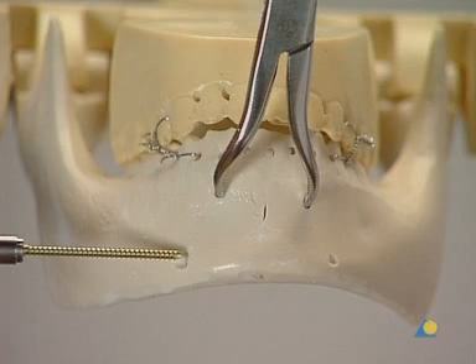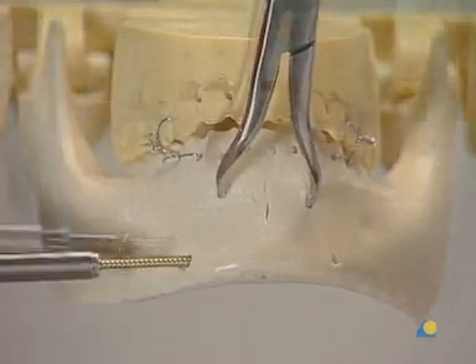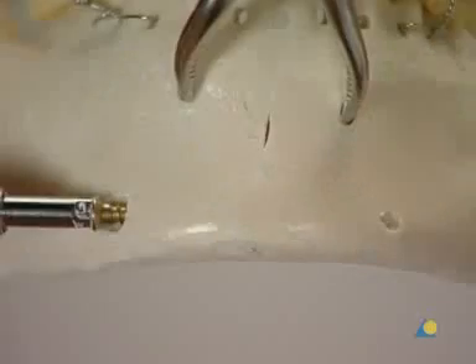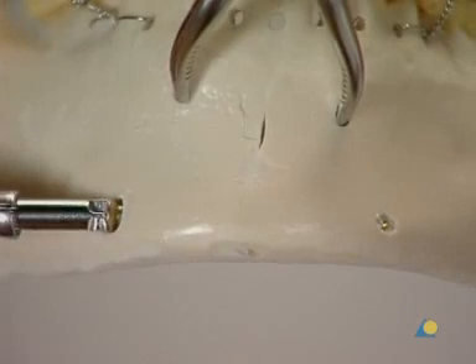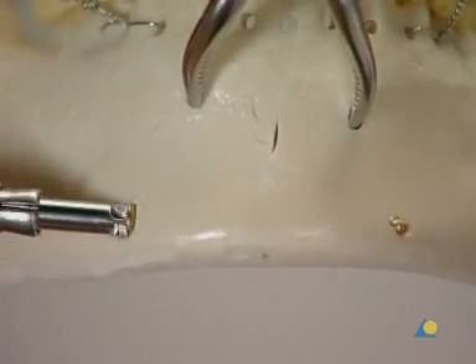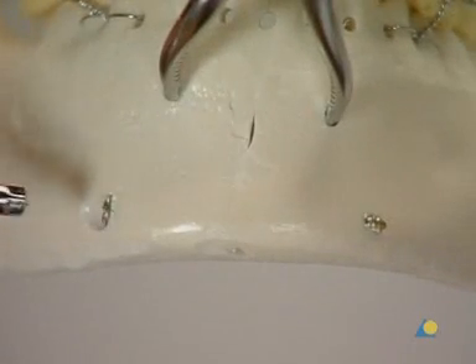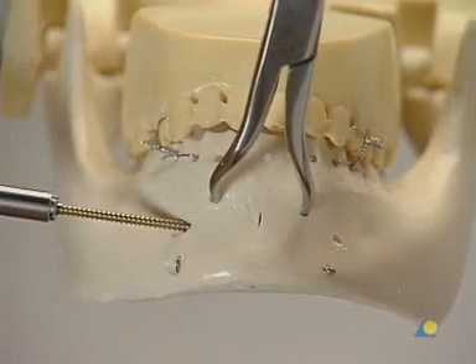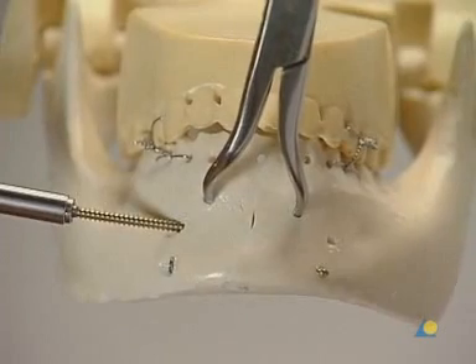It should be noted that the 2.4 mm screw glides through the near hole while engaging in the far fragment. Compression is achieved as the screw head engages into the countersunk portion of the near fragment. A second screw, parallel and superior to the first screw, is required to prevent rotation of the fragments.